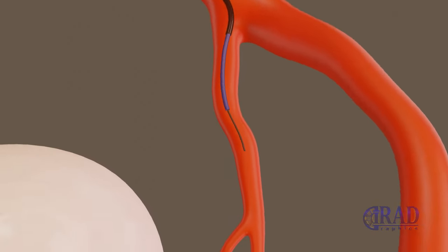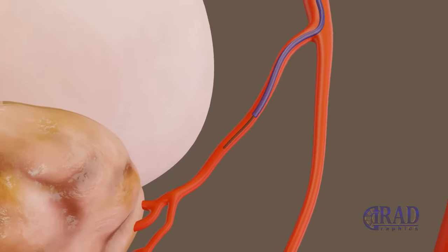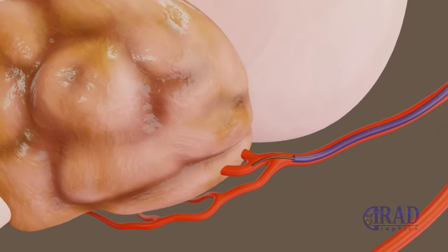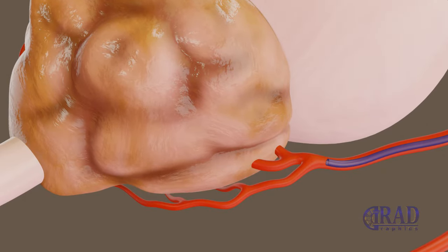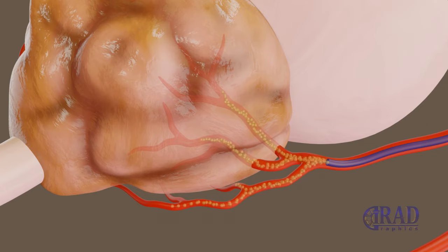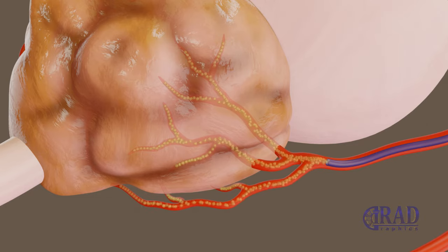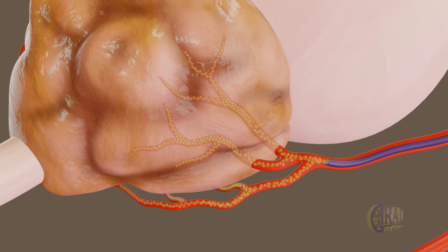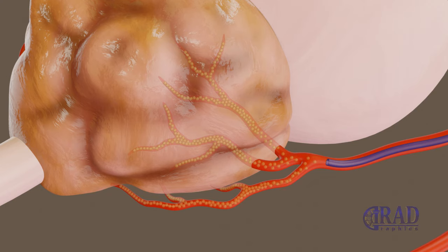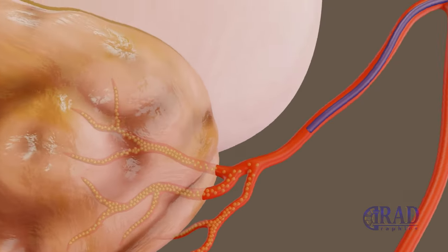A combination of microcatheter and microwire is advanced through the base catheter to select the prostate artery. Once collaterals are bypassed, the microwire is removed and prostate artery embolization is performed using particles until blood flow is ceased. Once embolization is completed, the microcatheter is removed.